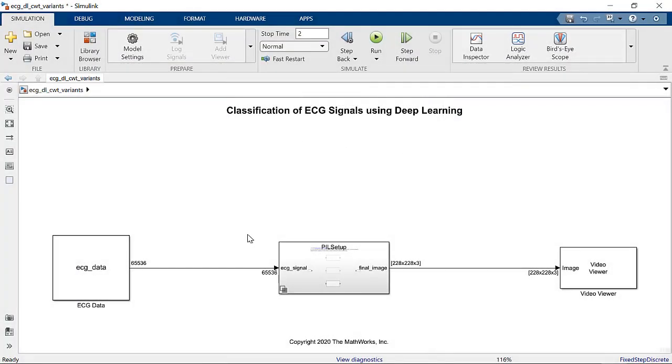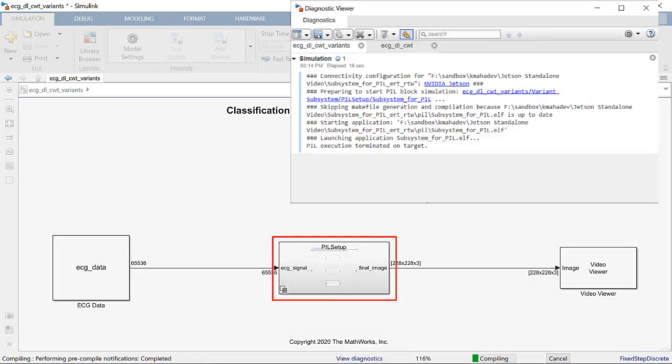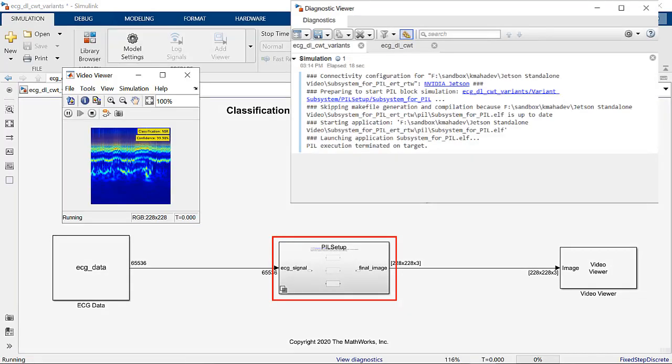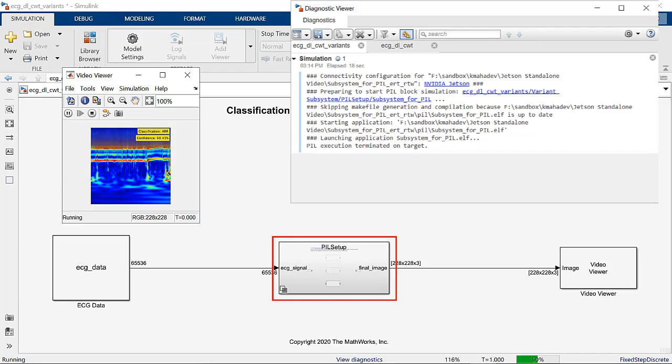On simulating the Simulink model with the PIL block, we see that complete application is running on Jetson and the results match with that of desktop simulation and SIL mode.